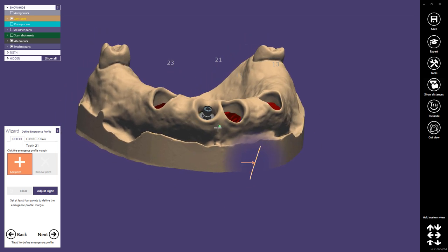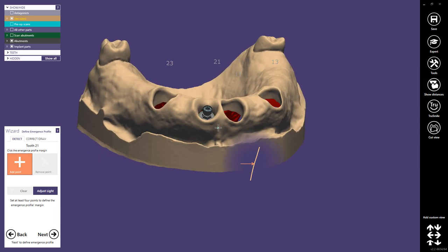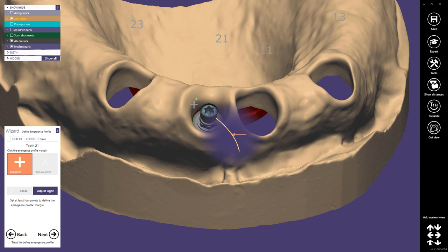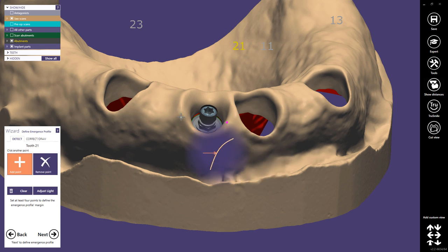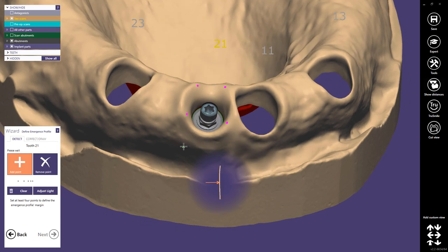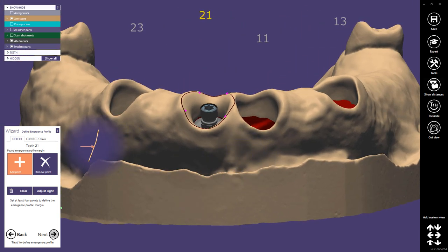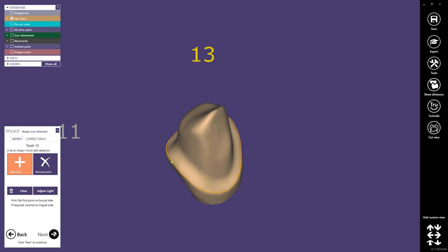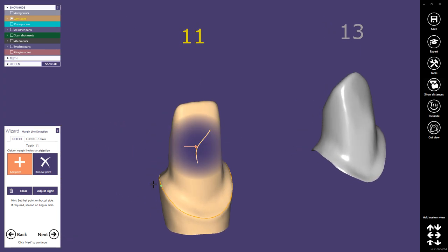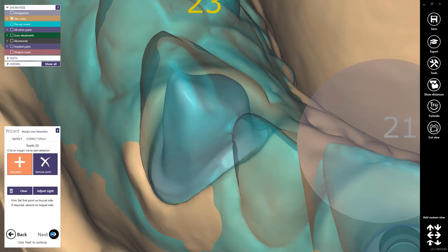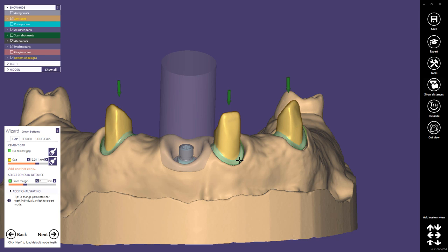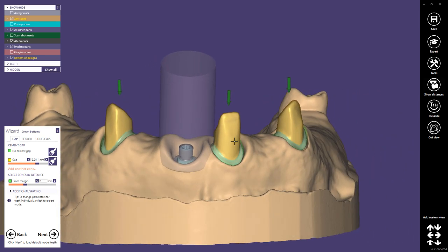Here we have to define the emergence profile, and this is a very important step for the telescopic implant because I usually do the emergence profile a little bit different than for just custom abutments. We detect it with four points. In the next step where I design the emergence profile, I do it a little differently. The margin lines had already been saved before, so we can just apply them again and proceed.